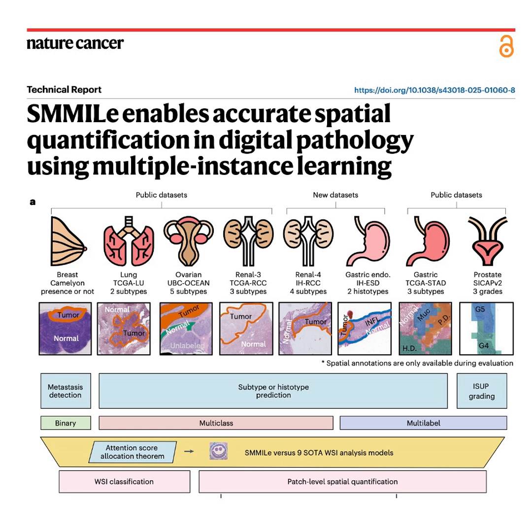Okay, right. And to really grasp the scale of a whole slide image, I want you, the listener, to imagine trying to find Waldo. Classic Waldo. But you aren't looking in a regular picture book. Imagine trying to find Waldo in a gigapixel-sized image of an entire sprawling living city. Yeah, billions of pixels. Current AI can look at that giant image and easily tell you, yes, Waldo is definitely somewhere in this city. And that is basically WSI classification.